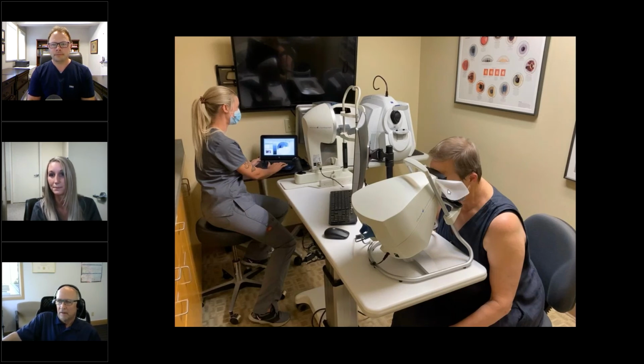Correct. Okay. You mentioned that you need to use trial lenses less often. I didn't quite understand that. How are you using trial lenses less often? So I did a study where I took, I think it was 100 patients, William? Yeah, I think it was a little bit more, but yeah. I actually dug into their manifests and determined if they needed a correction or not. If they needed a distance correction, then we would correct for it. But near is not necessary.